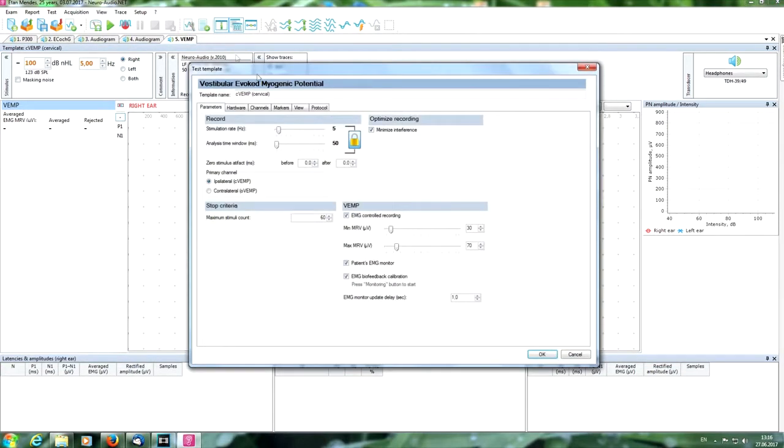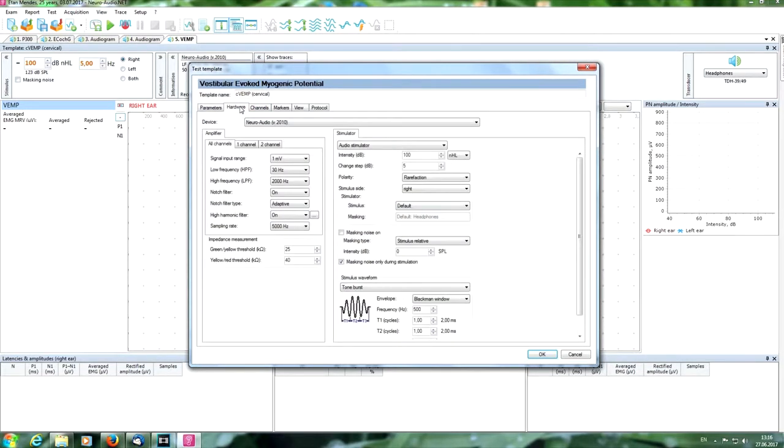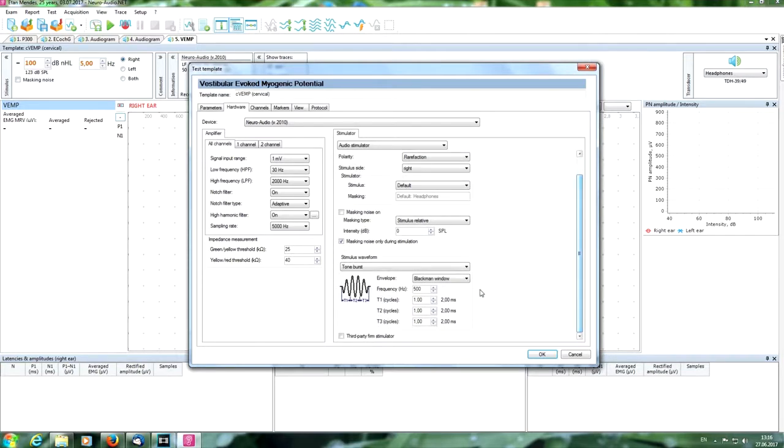We can see here the hardware parameters, filters, sampling, and so on. Impedance levels we can see here. The stimulus parameters can be changed if you want. If it is okay, press okay.